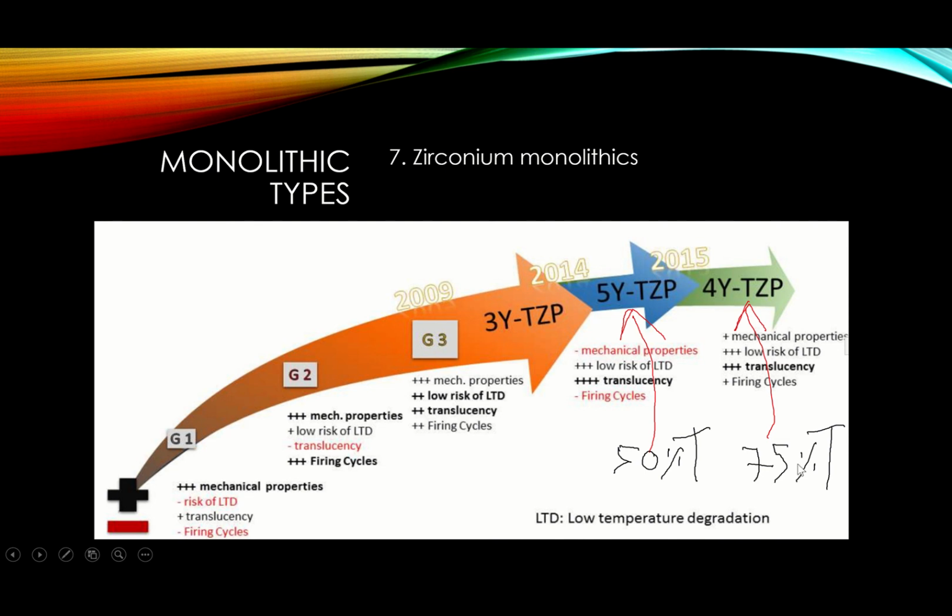So in other words, the tetragonal content is related to the strength. More tetragonal content in the zirconia block, more strength and less translucency. Now, less tetragonal content is less strength, and you can fill up the other 50% with cubic zirconia to substitute for the yttrium stabilizer, so it will be more translucent, but it's less mechanical property.